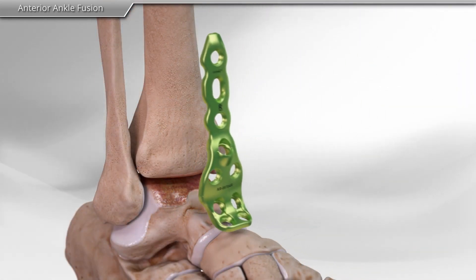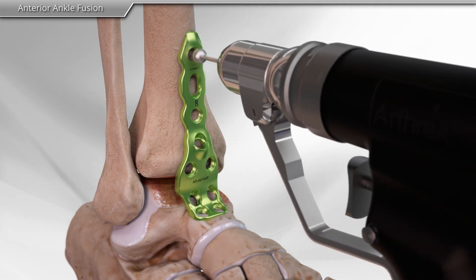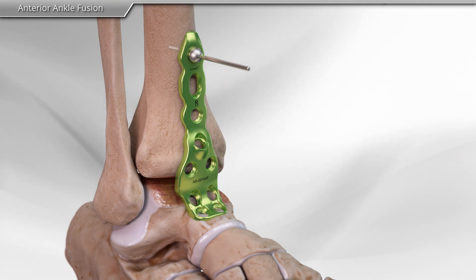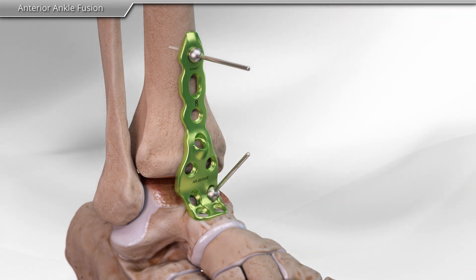After the joint surfaces have been prepared, your surgeon will place the plate over the ankle joint. The anterior ankle fusion plate is anatomically designed to contour the shape of the joint. Two temporary pins are used to hold the plate in place.